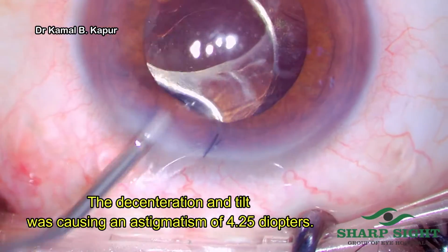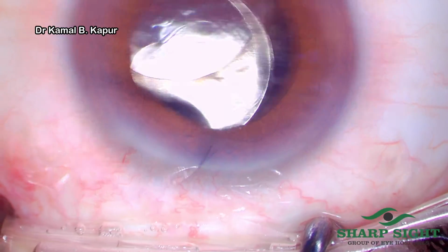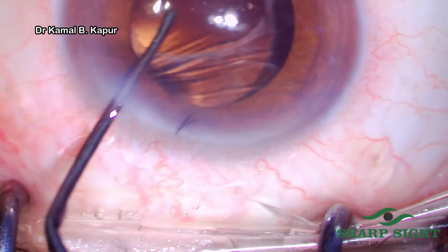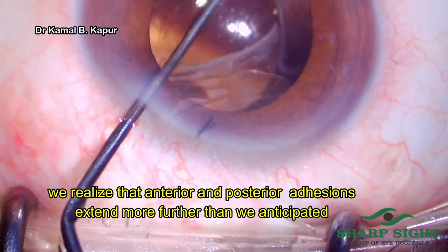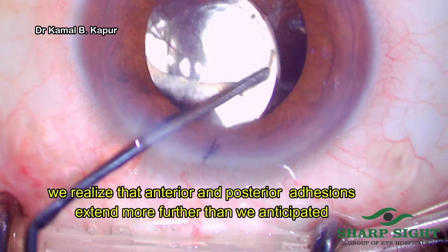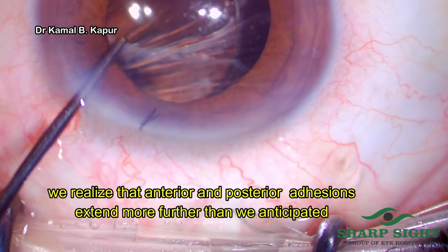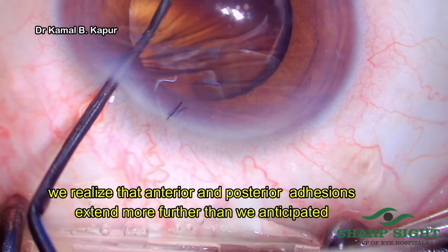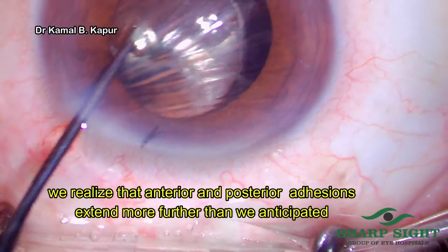We re-strategize and then we actually try and rotate the lens in a direction so as to attempt to break the adhesions. Once we realize after repeated attempts that the IOL does move a bit, but it tends to come back to its original position.